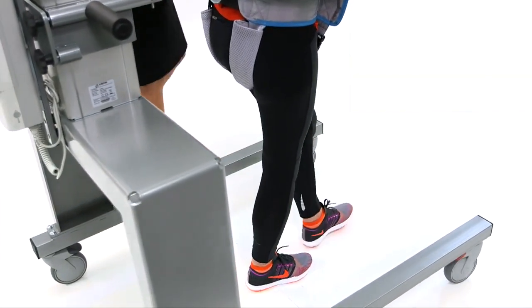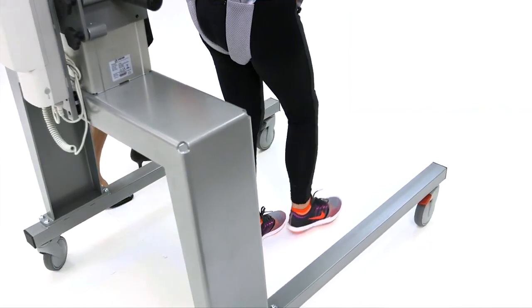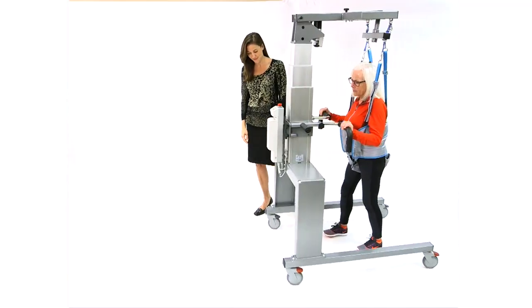This provides visual feedback to the patient and clinician during the rehabilitation exercises.